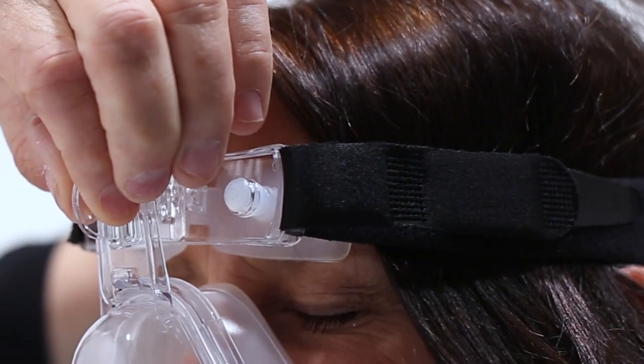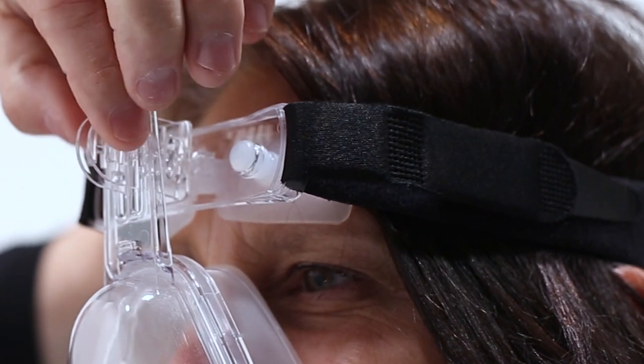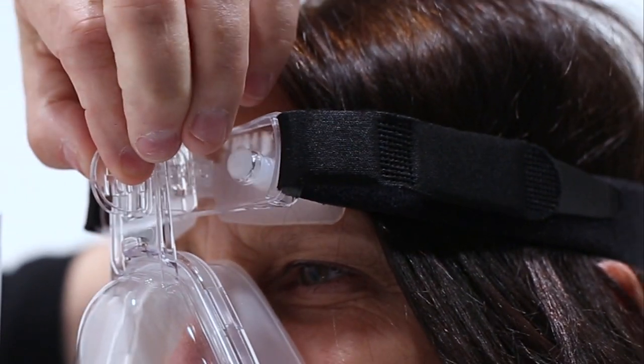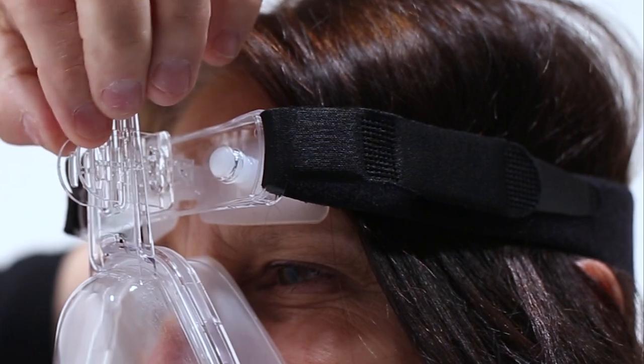One thing to note is that our mask has an Omniclip feature. This allows you to move the mask in and out and up and down to fit your patient efficiently.